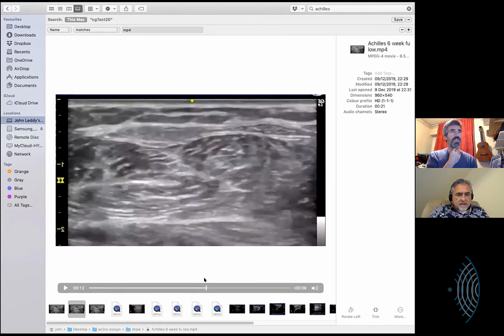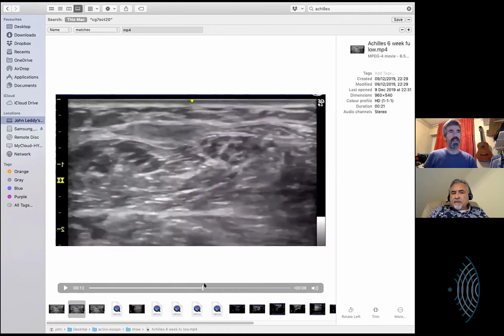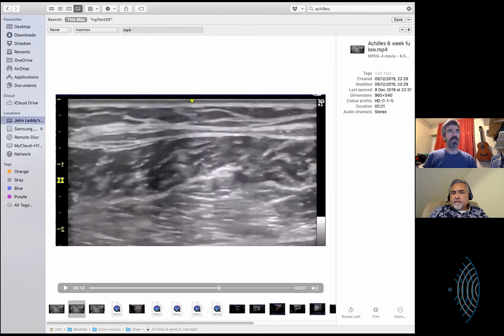What I want you to do is to think first of all about this bit here, because the pathology is going to be here. If we ignore that for the moment, you'll see this becomes a homogeneous, almost stingray-shaped aponeurosis. A little bit less normal on this side, but still looking at that right side as we go up, I'm going to take your mind off that because it's clearer here. Do you see this aponeurosis here? Yes. That's soleus aponeurosis, and that's gastrocs aponeurosis.